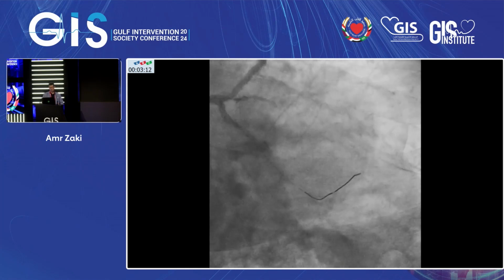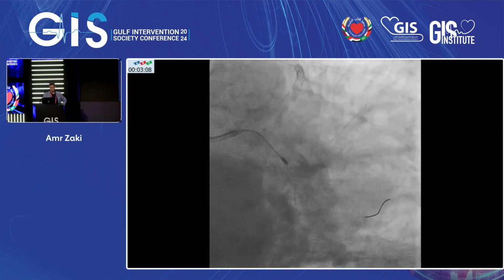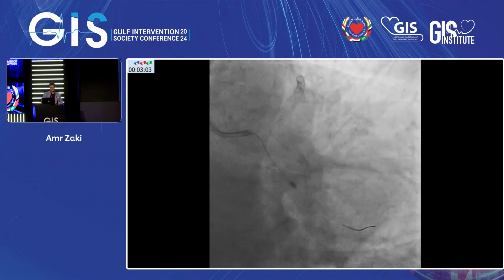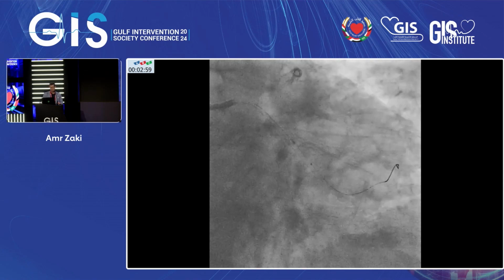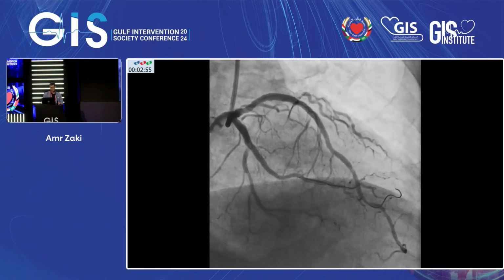The CX is much more complex here. So the burr also, I took the 1.5. The 1.5 did cross after speeding high up, the same concept, 1-to-1 balloon, and then a long stent, with an excellent result.